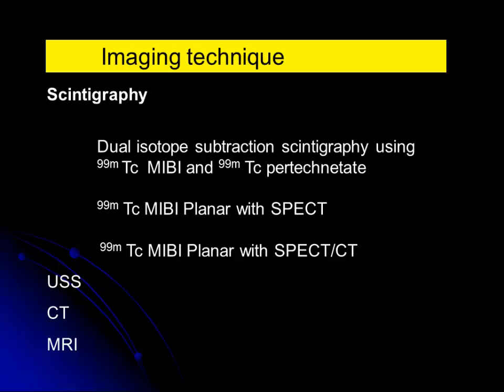CT can add, but we have mostly done SPECT CT; now we are starting to utilize contrast CT. Some centers in the UK are utilizing that, and they have shown the significance of detection. As for MR, the only center where I have seen and worked was Oxford, where they used to do triple assessment. The patients used to have MR, ultrasound, and maybe a scan.